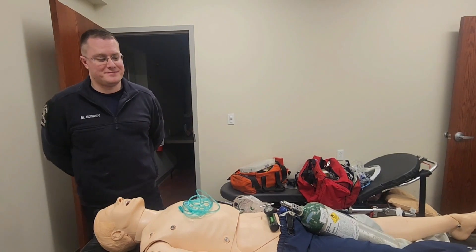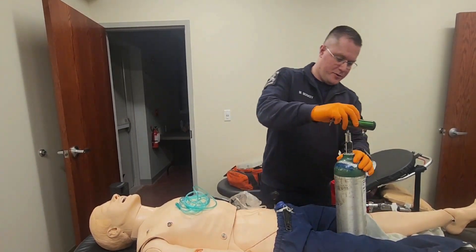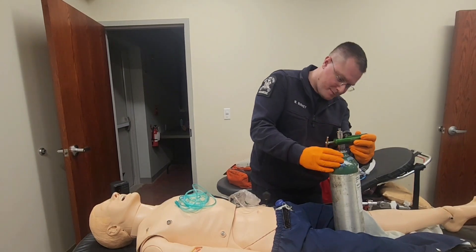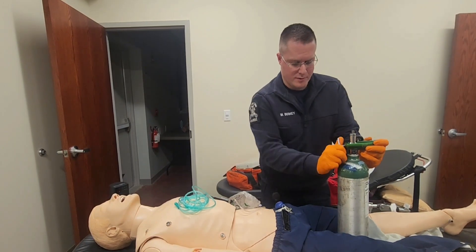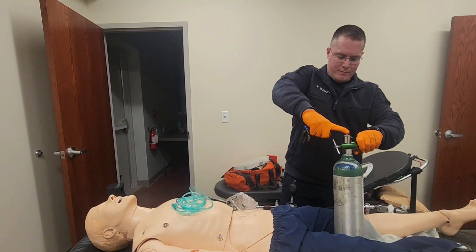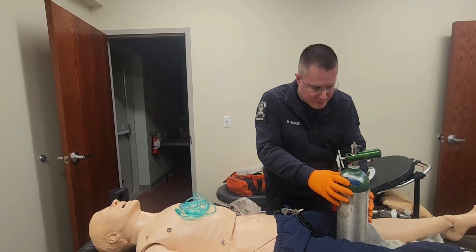I do not. So I'll start by wearing my BSI. I'm going to take my oxygen cylinder and attach my regulator to it. I'll tighten it down and open it up. I do not see any leaks. My pressure gauge is reading at 2,000 pounds.